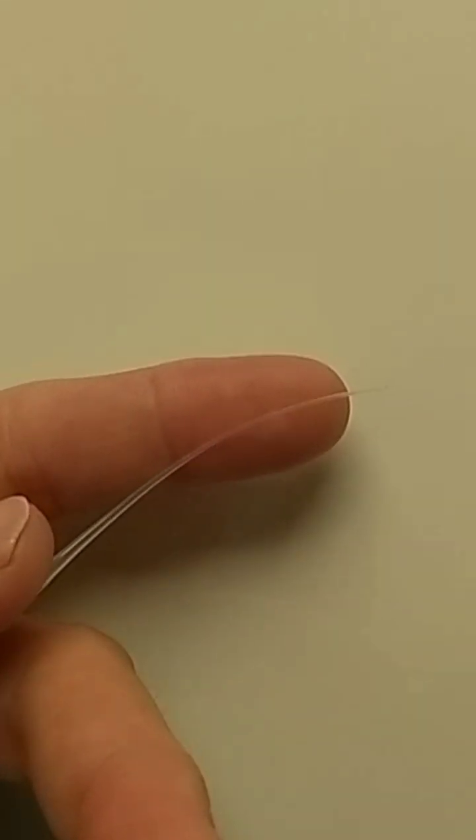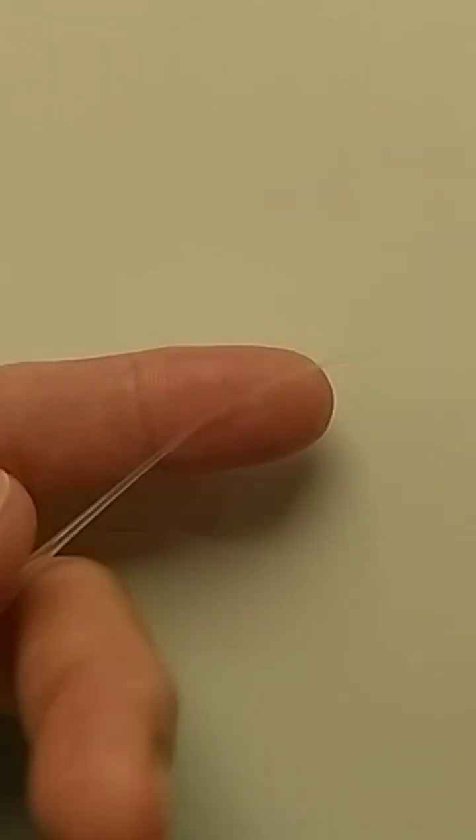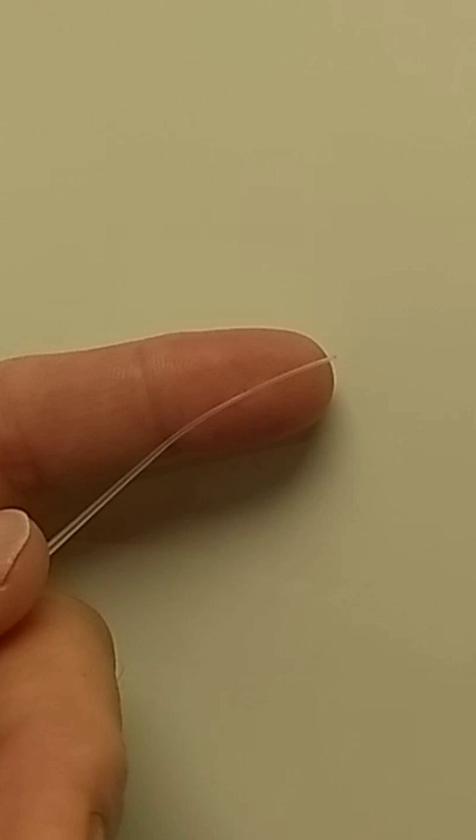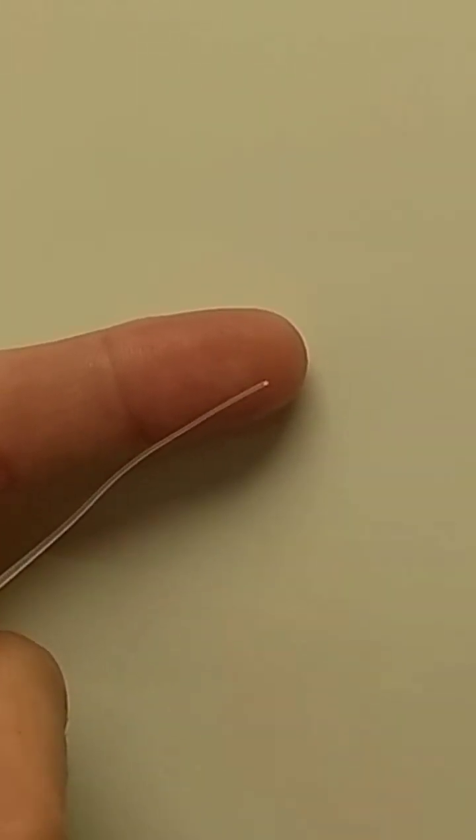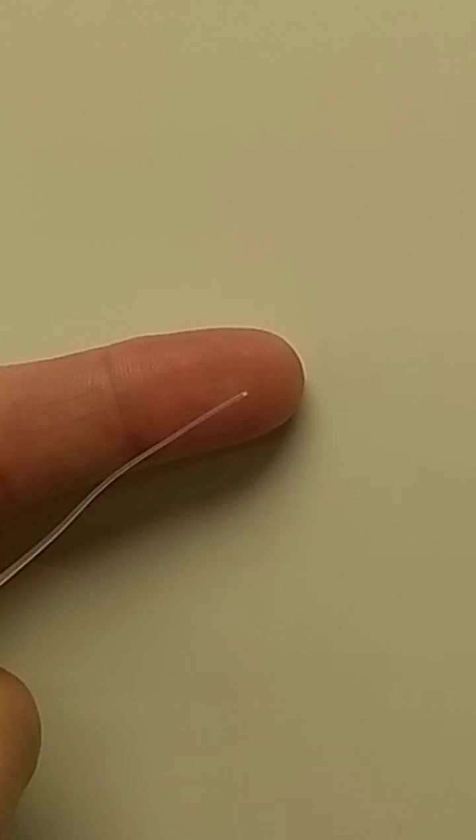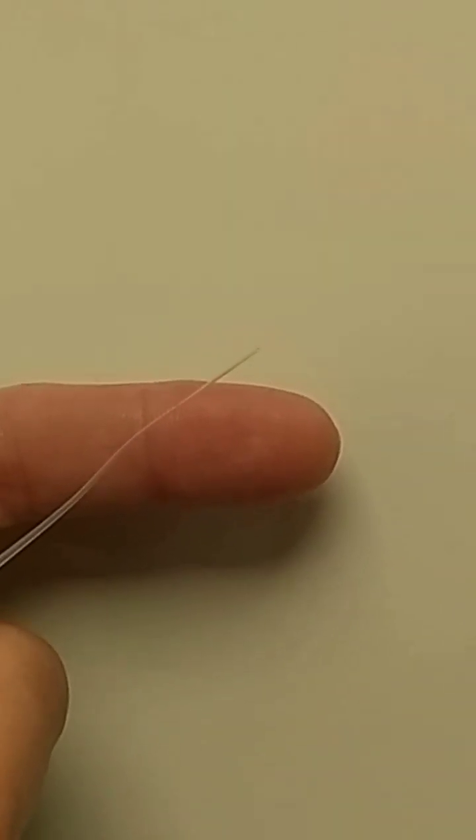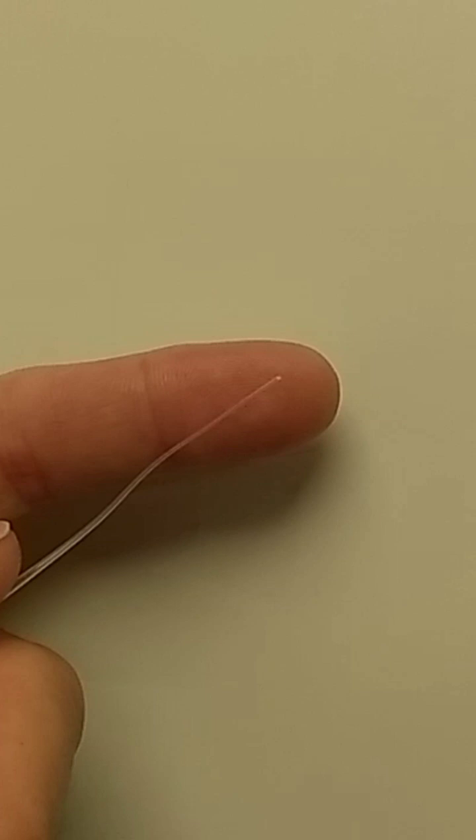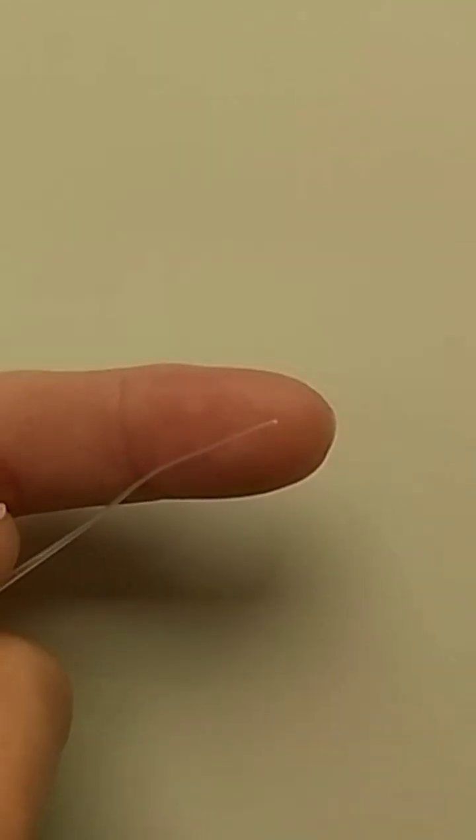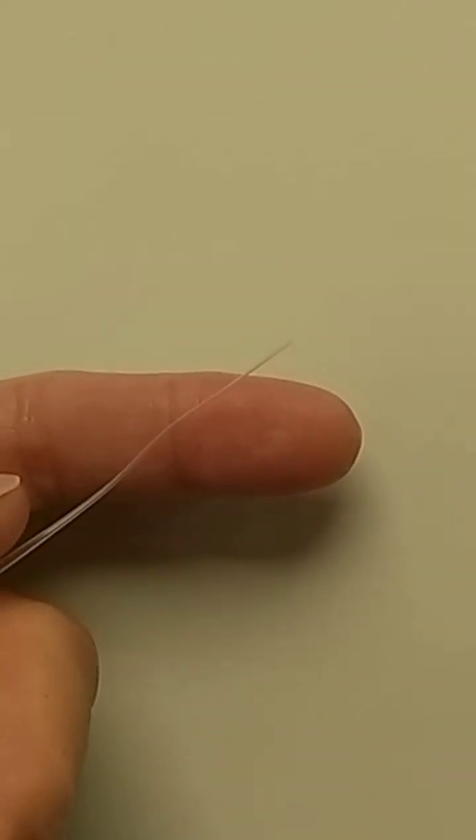It's very difficult to nasal flush small baby tortoises or small species such as Egyptian tortoises or Patlopa tortoises from southern Africa. So it's a good idea to use one of these flexible micro capillary attachments for syringes.